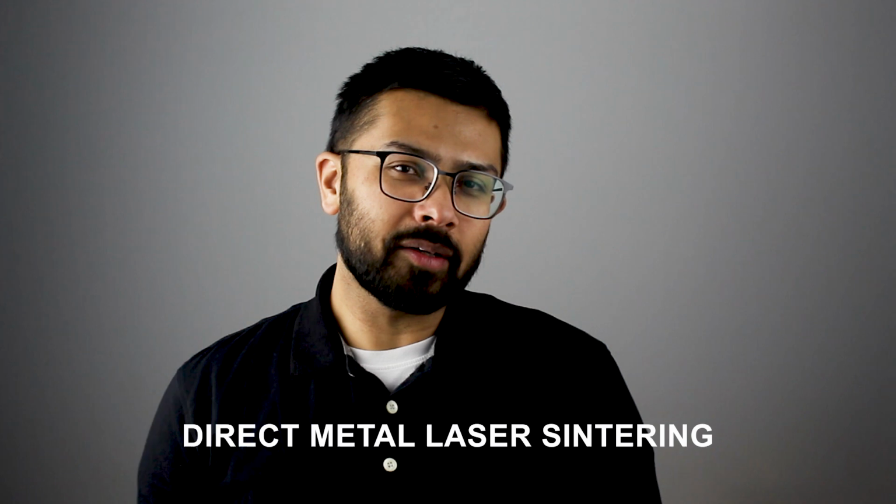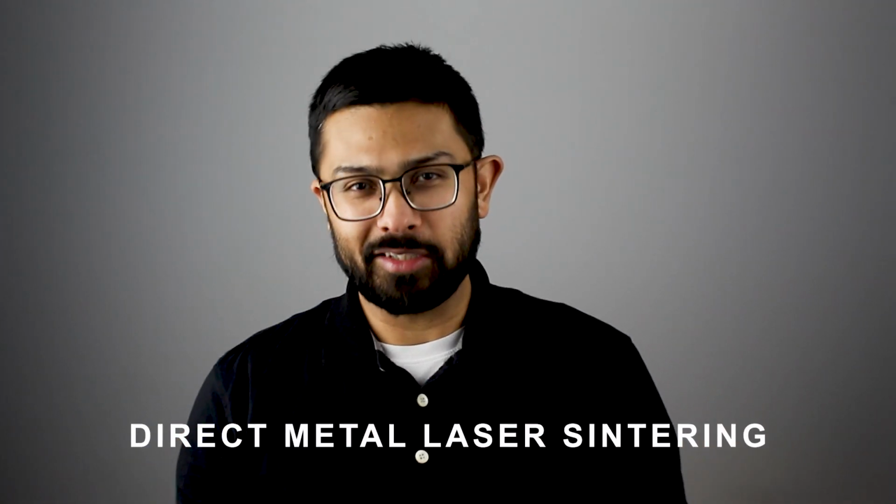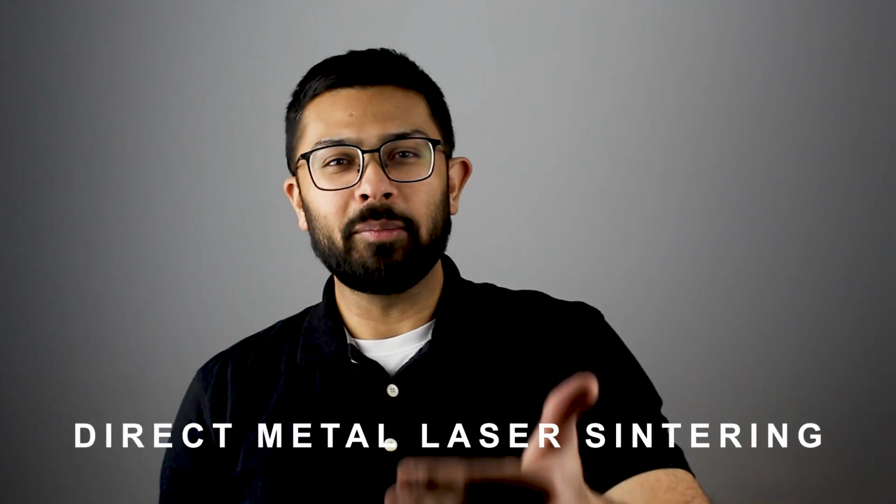And then there's direct metal laser sintering, a 3D printing technology that creates metal restorations layer by layer, eliminating the need for traditional casting altogether. While these technologies offer incredible benefits, casting remains a widely used and cost-effective technique for many dental restorations.